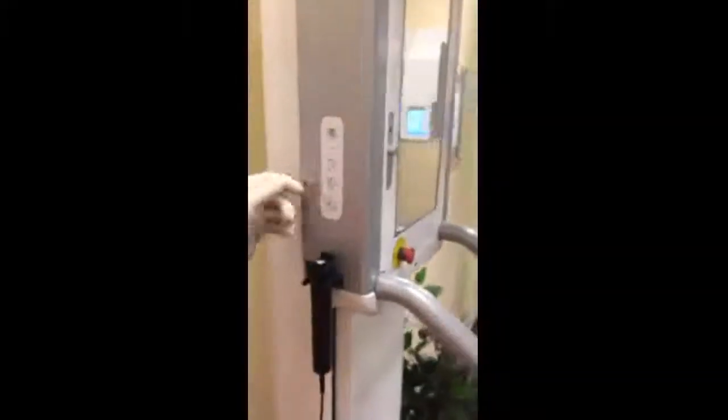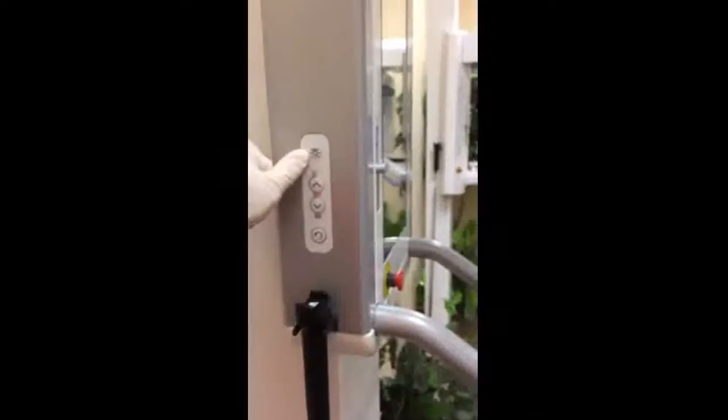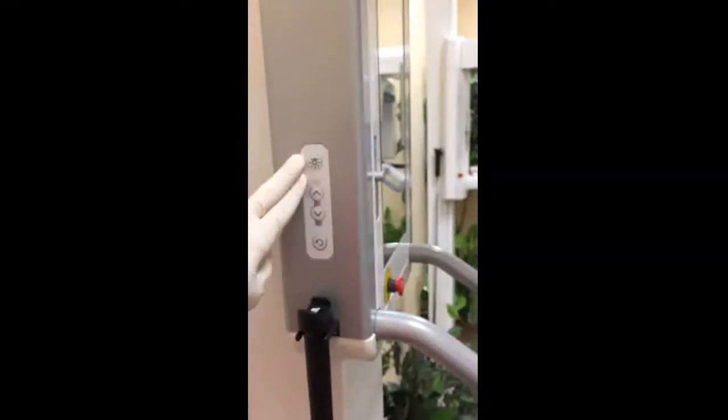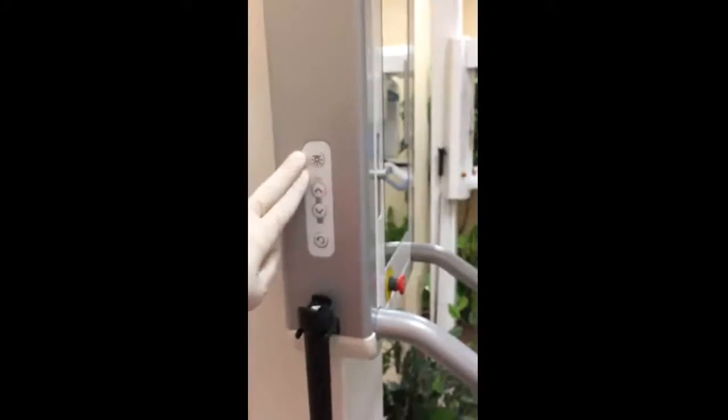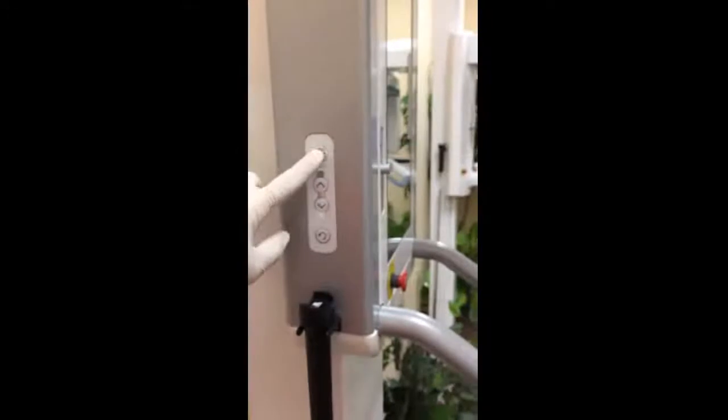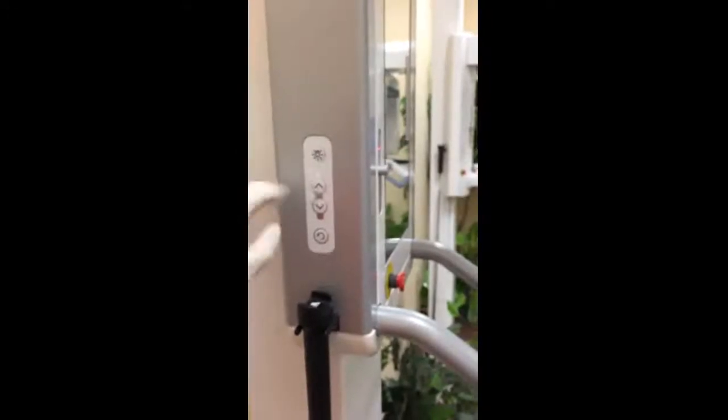The controls on the side of the machine, we'll start at the top. There is a light bulb button. This button turns your laser lights on or off. You have a mid-sagittal line, a Frankfurt plane light, and a canine light. They turn off every 30 seconds. This light bulb button would simply turn them back on.